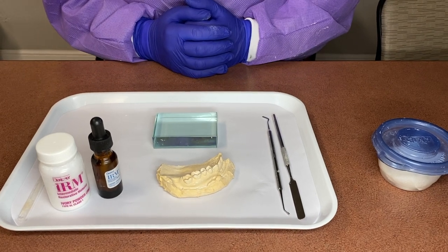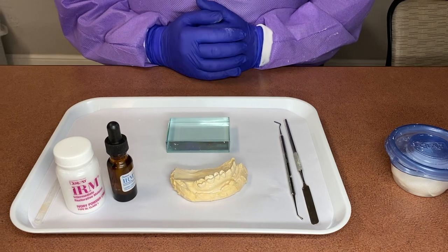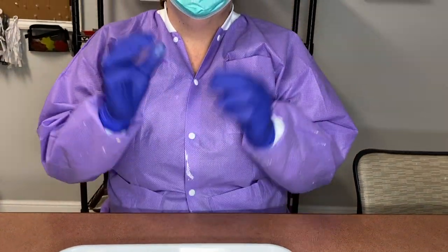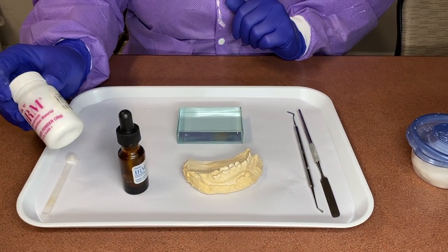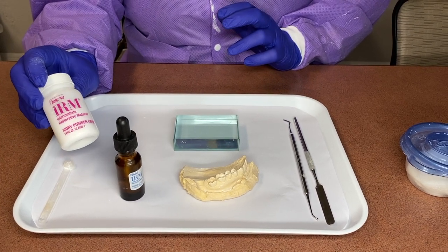Today we are going to be explaining IRM and Cavit, and we'll jump right in. First, you'll want to start with your PPE, your personal protective equipment: your gloves, jackets, your masks, and your goggles or glasses. Today, this is the IRM. It's an intermediate restorative material, which is a powder and a liquid. It is used for a sedative filling.